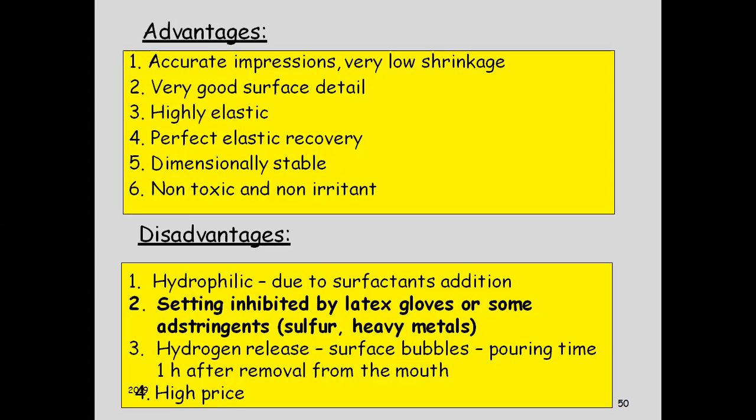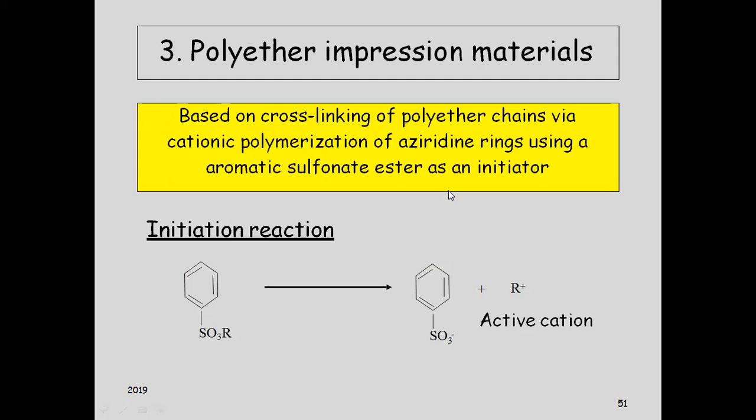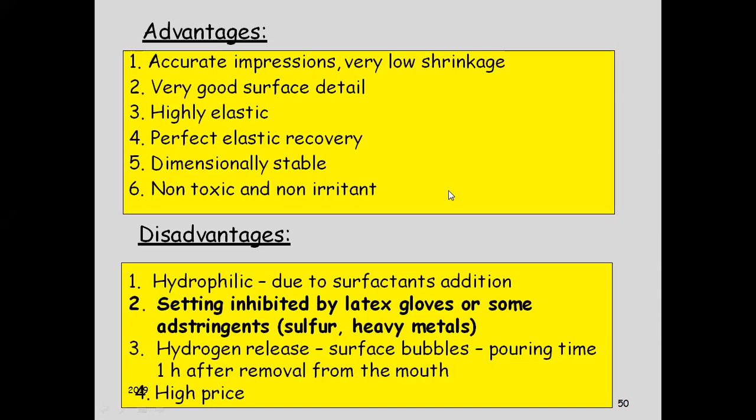Setting is inhibited by latex gloves or some astringent-like materials. Hydrogen release, surface bubbles, pour time 1 hour after removal from the mouth. It is of high price.